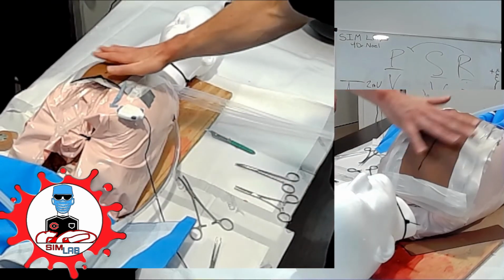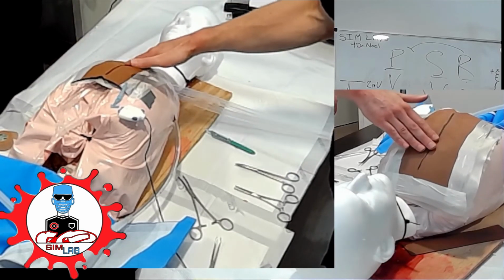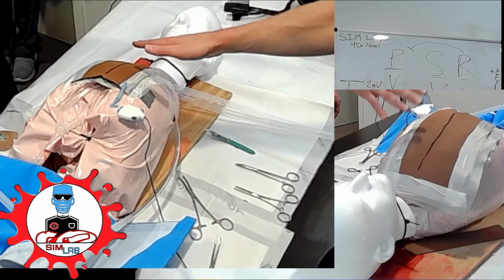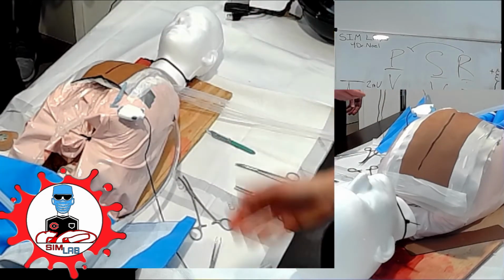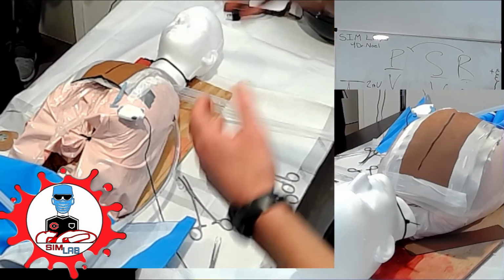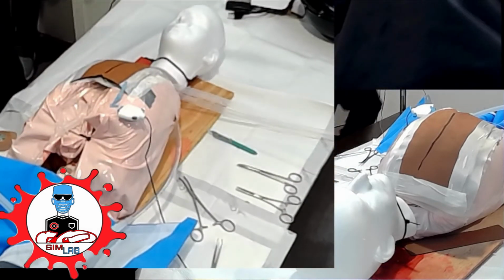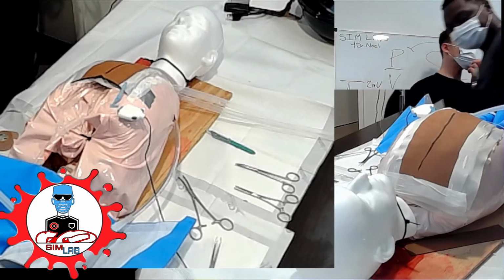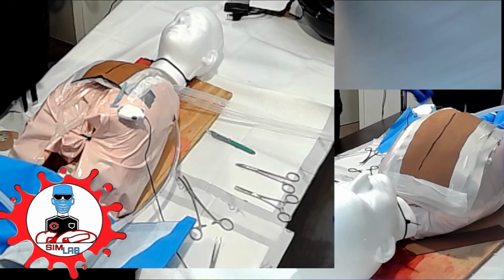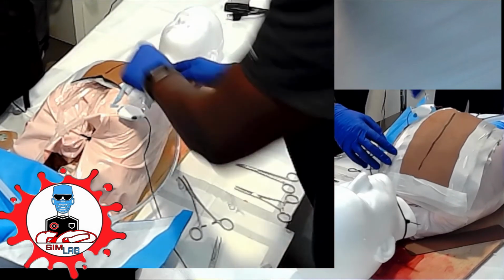So they're doing CPR. When you're disrupting the sternum, there are wires right under here, so one thing we often do is grab a lunch tray or something to try to protect the person doing CPR. As they're doing CPR, you guys are getting sterile, getting everything prepped to then pause CPR, drape, resume CPR as someone sterile is doing CPR, and then open the chest up. So that's happening, and move quick. When you're talking about drape, take a bottle of betadine, just shoot it on the chest and move on. Okay. So I guess get the scalpel, make an incision within the chest.